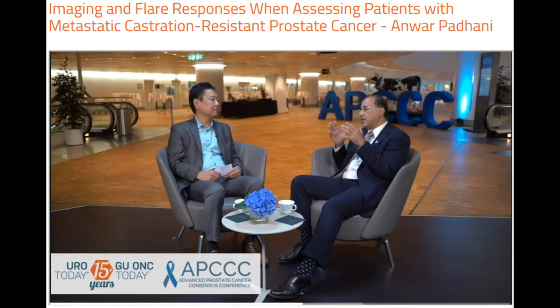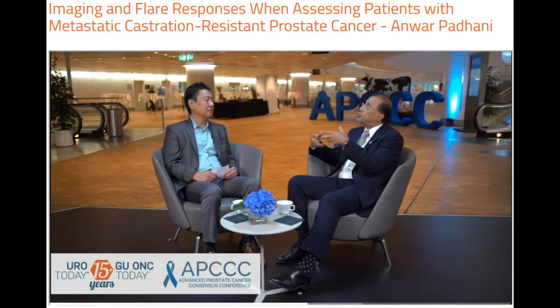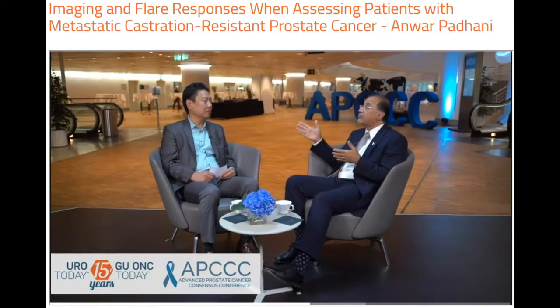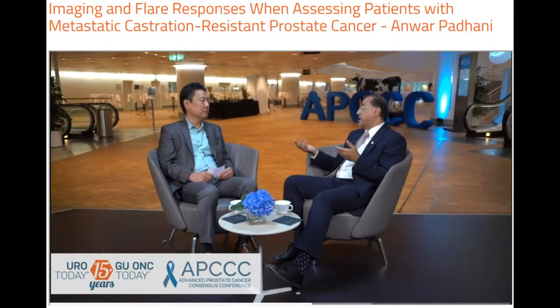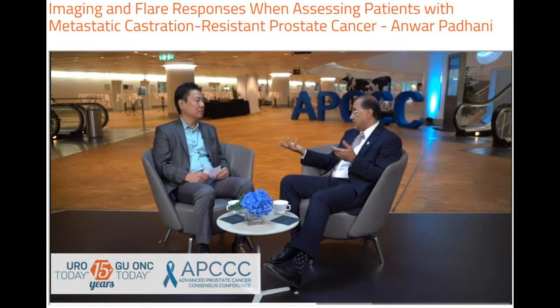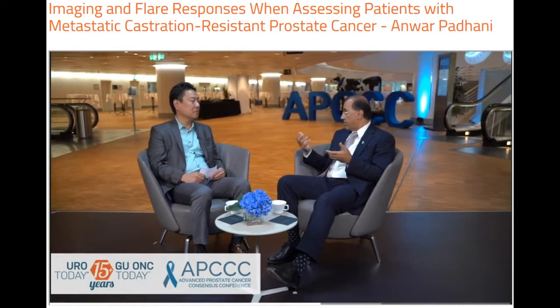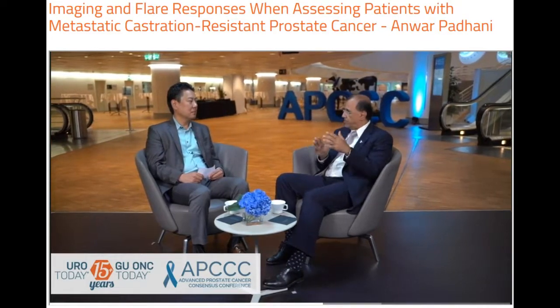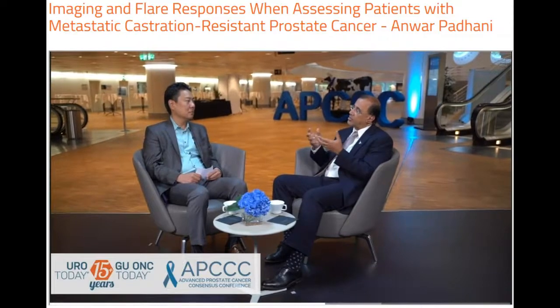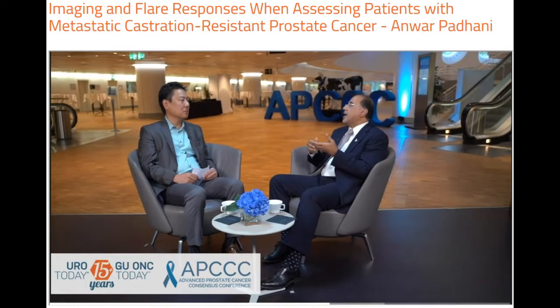Yes. So the essential thing is that we need to monitor the tumor, not the matrix response to the presence of tumor. And that's how functional imaging comes in. So you can use something like choline or PSMA, which directly looks at the health of the cells. So that's why they make sense. Similarly, you can use MRI, particularly diffusion MRI. And diffusion MRI looks at the cellularity of the bone marrow, because that's what we're talking about, and the cellularity of the tumor cells within the bone marrow.